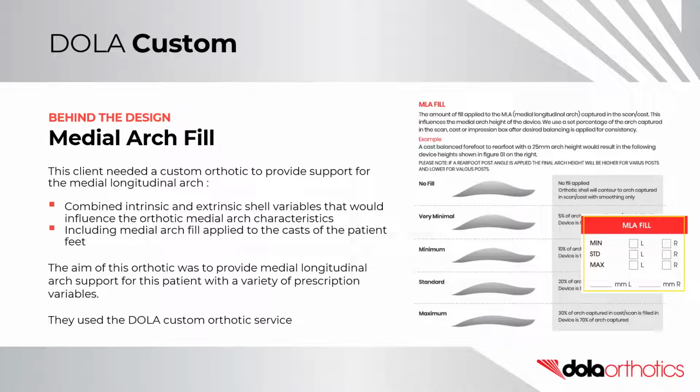Behind the design: Medial Arch Fill. This client needed a custom orthotic to provide support for the medial longitudinal arch. They recognised that their combination of intrinsic and extrinsic shell variables would influence the orthotic medial arch characteristics, including their selection of medial arch fill applied to the cast of the patient. The aim of this orthotic was to provide medial longitudinal arch support with a variety of prescription variables.